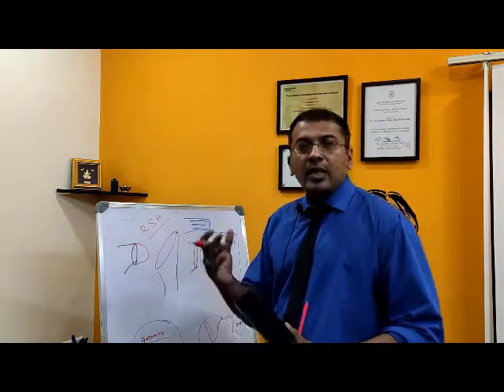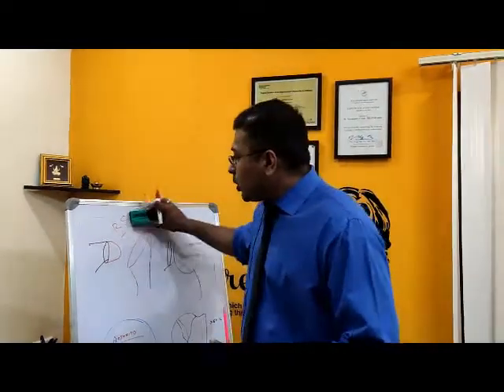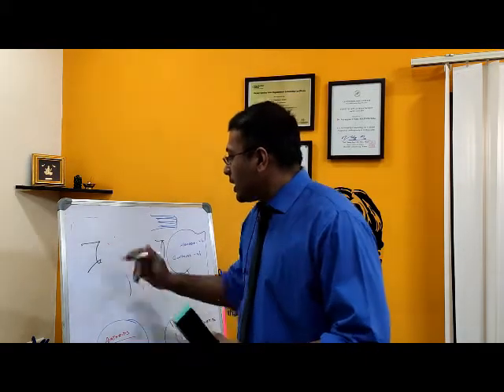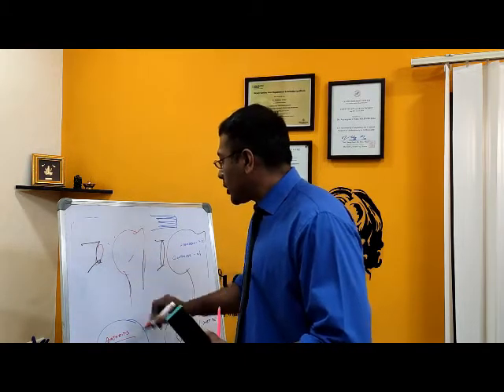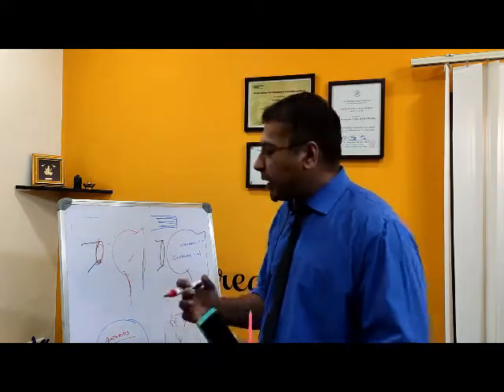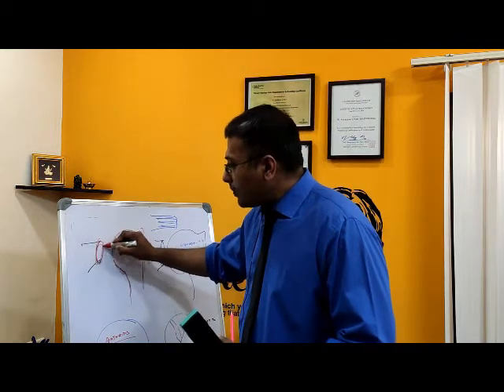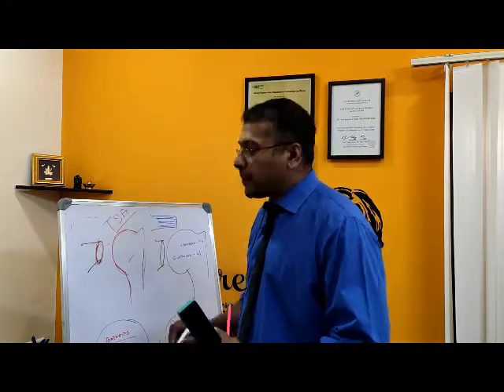We should not confuse this with a procedure called total shoulder replacement. Here, this is the ball and this is the socket, as in a normal shoulder. In severe arthritic cases, we just replace the existing ball with a steel ball, and the socket is replaced by plastic. That is called total shoulder arthroplasty or total shoulder replacement.